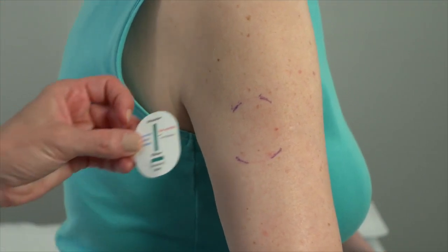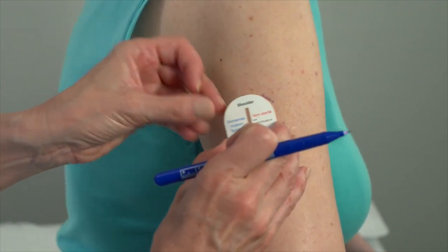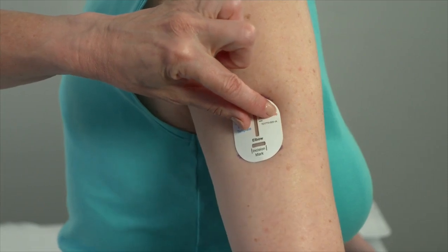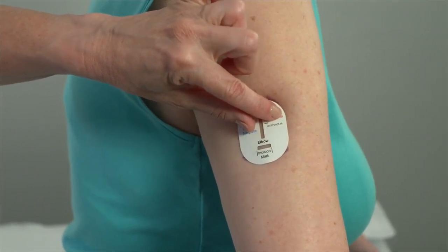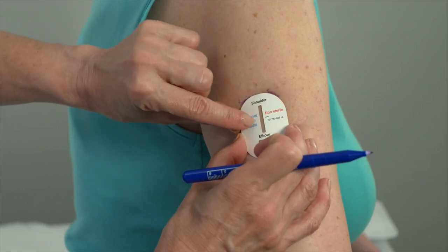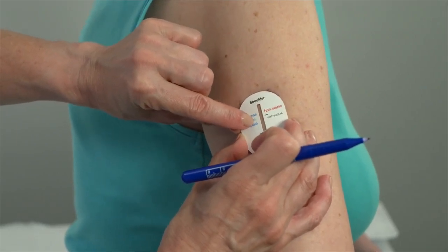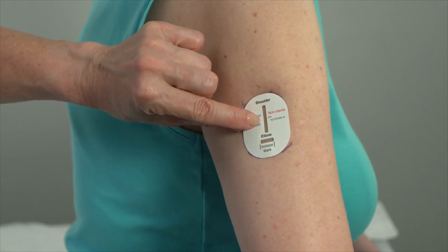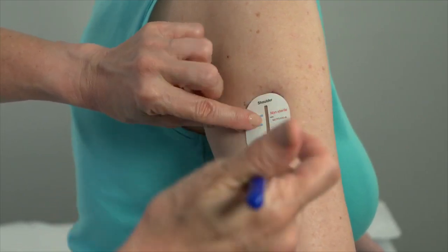Place the non-sterile incision template inside the marked lines. Mark the horizontal and vertical lines on the skin. The horizontal smaller line indicates the incision location. The longer vertical line indicates the sensor pocket path and should be parallel to the humerus bone.